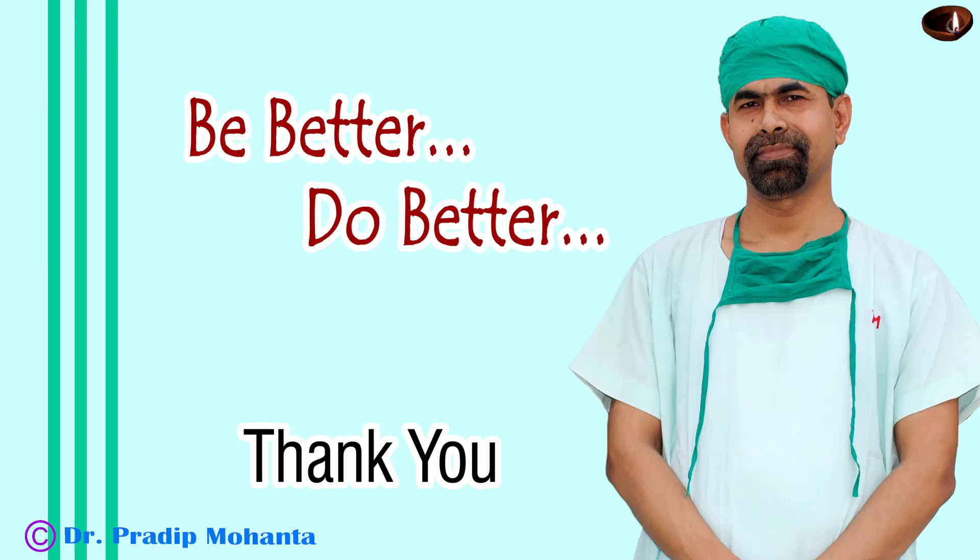So this has been a very satisfactory surgery. The zonule is weak, but still we have managed it nicely. Thank you very much for your attention. Hope this video will help you in developing your surgical skills. Be a great surgeon and serve mankind with love, respect, compassion, and great surgical competence.